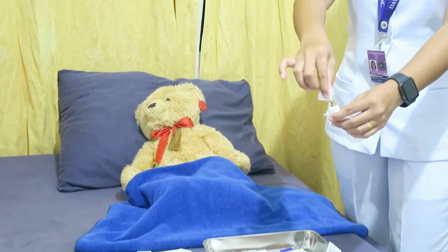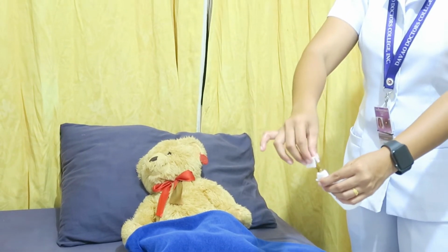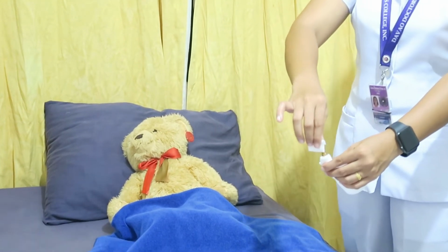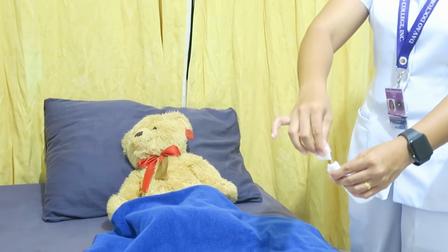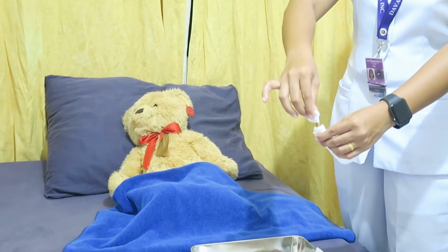The rationale for that is the sterile gauze or the cotton ball protects fingers from the broken glass and the glass fragments. And then, place the antiseptic wipe pocket over the top of the ampule before breaking off the top. Then, after that, dispose of the top of the ampule in the sharps container.